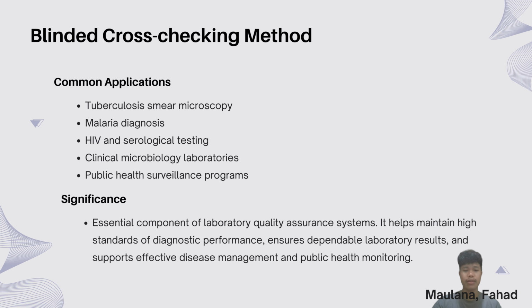Finally, the blinded cross-checking method is commonly used in tuberculosis smear microscopy, malaria diagnosis, HIV and serological testing, clinical microbiology laboratories, and public health surveillance programs. In summary, this method is an essential component of laboratory quality assurance systems. It helps maintain high diagnostic standards, ensures dependable results, and supports effective disease management and public health monitoring.